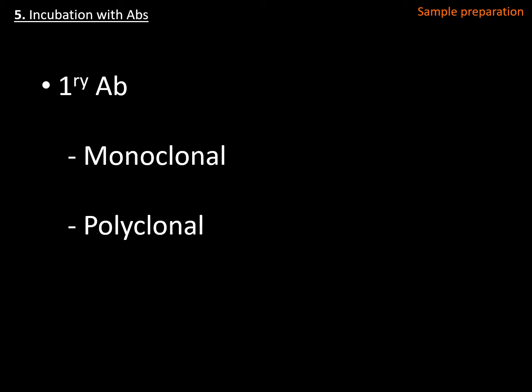This can be monoclonal, meaning that they are only of one species of antibodies and only detect the same epitope, or polyclonal, which are normally produced after the injection of an animal with your antigen.